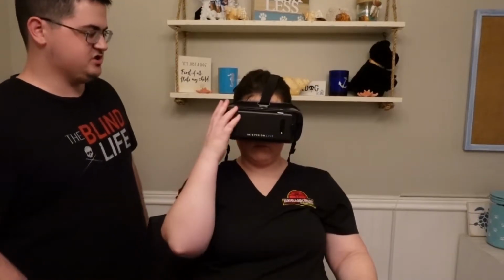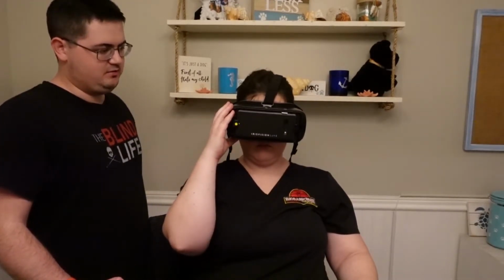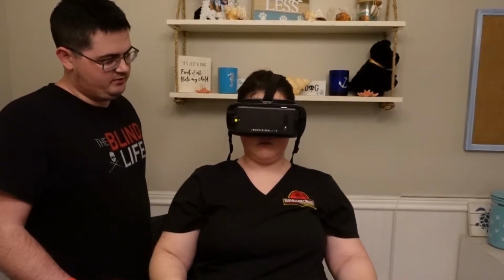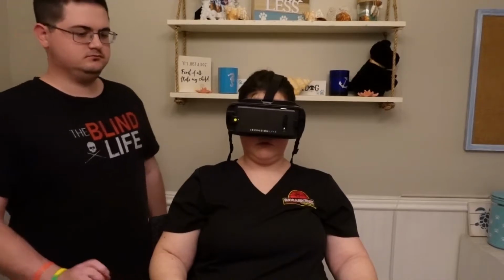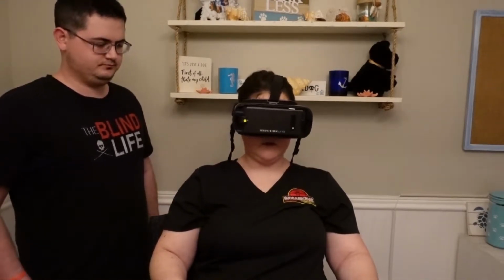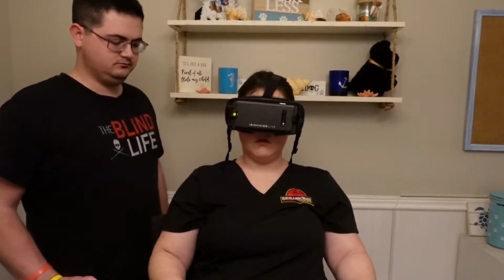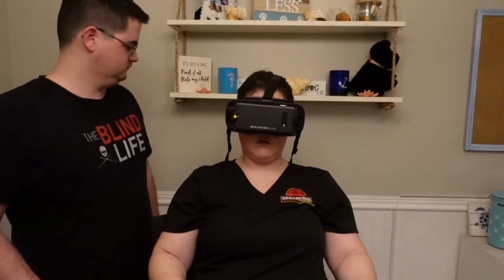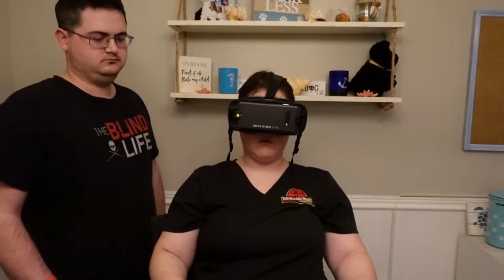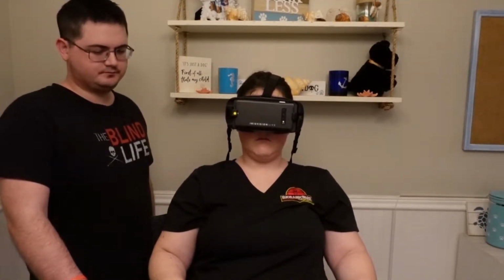All right, so television, we might not showcase, we probably will just explain, but go ahead and press the button, Lexi. Okay, I'm on television. All right. So television mode is great for viewing the display on your television or computer screen. To optimize your viewing experience and camera lighting, it is best to center yourself in front of that screen. Television uses the camera's exposure compensation to provide the best viewing experience.